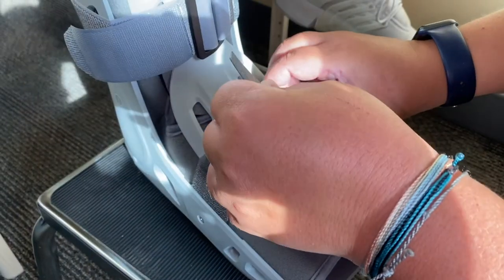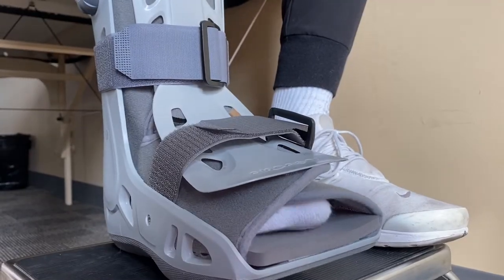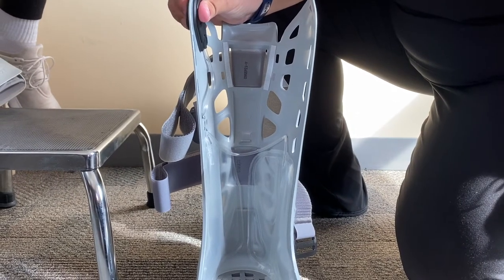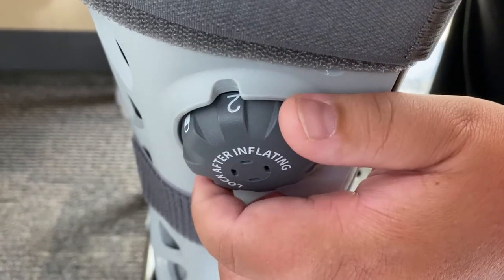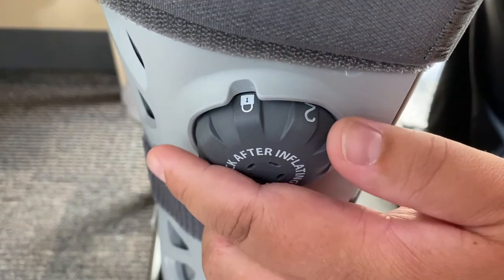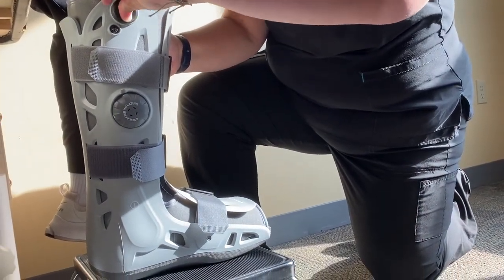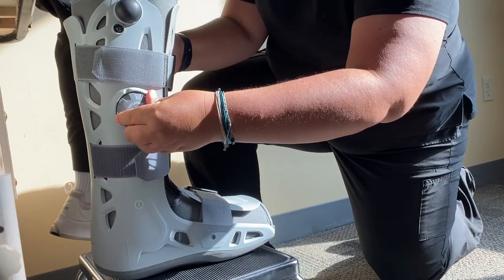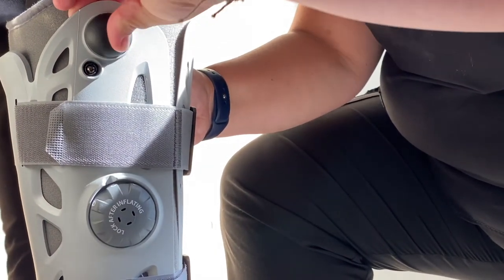To fix this, simply unfasten and refasten the straps by loosening or tightening as necessary. If your foot is sliding in the boot, or if you have extra space on the inside of the boot, you may use the air bladder feature to add additional compression to fill the space. If your boot is standard height, either side of the boot will have a number 1 or number 2 printed on it. Turn the dial to either number 1 or number 2 which corresponds to the air bladder on the respective side. Gently push the round inflation button a few to several times until the boot feels snug inside. You may then turn the dial to the other number and add air to comfort, or turn the dial to the lock setting to secure the air in place.